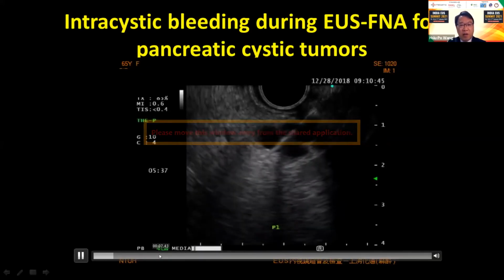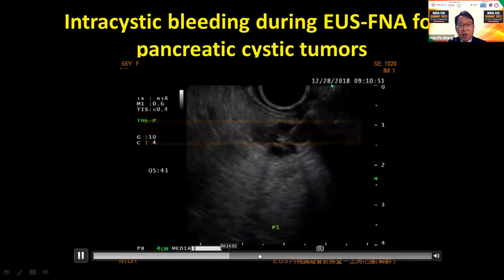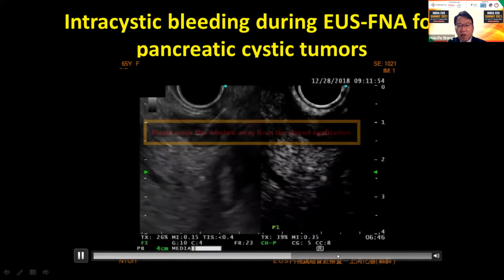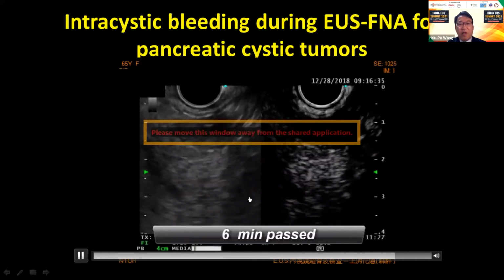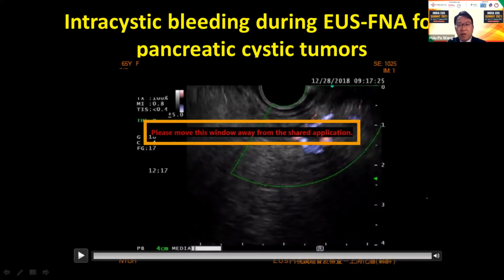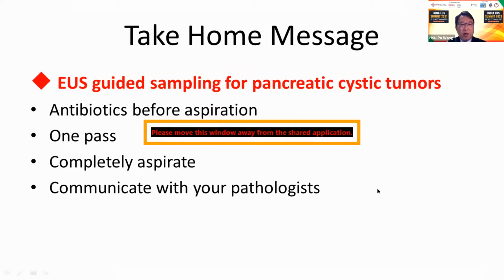This is our case. After the puncture, it showed bleeding, and after 6 minutes, we will show the bleeding.